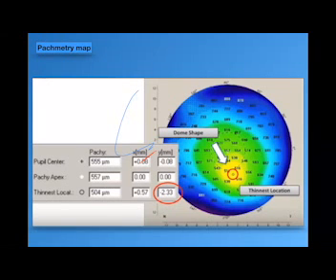But if you have it all borderline with normal topography, you can go for refractive surgery in such a patient, but take the safety margin by going for the surface ablation, not to cut. You can, but you shouldn't. What you shouldn't do, to be on the safer side.